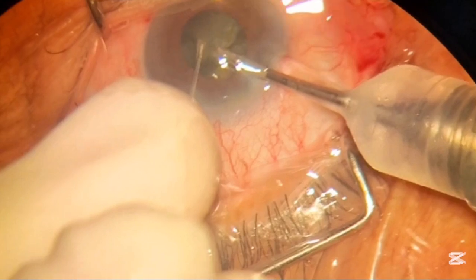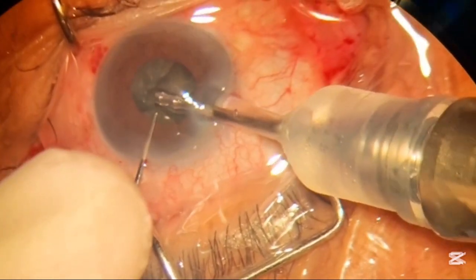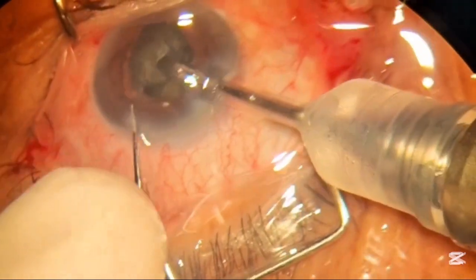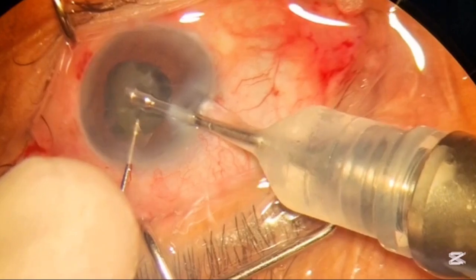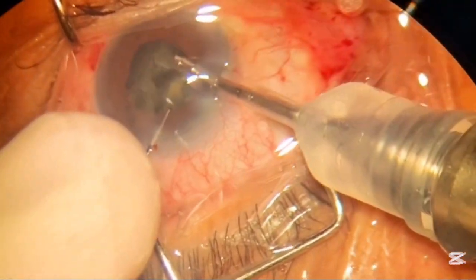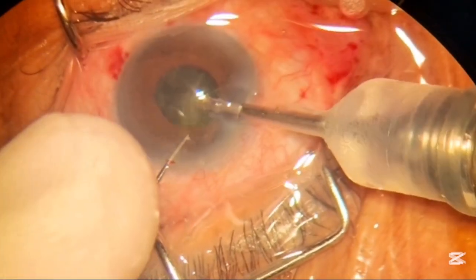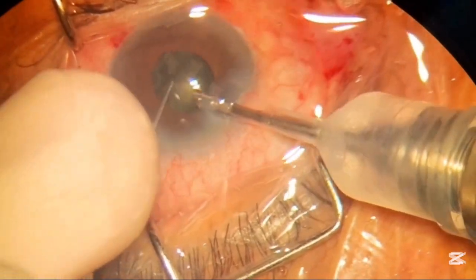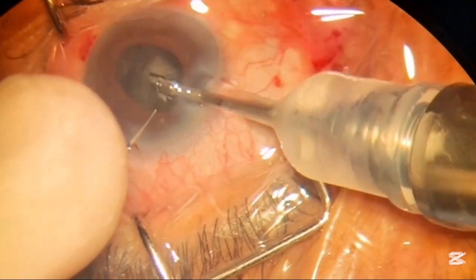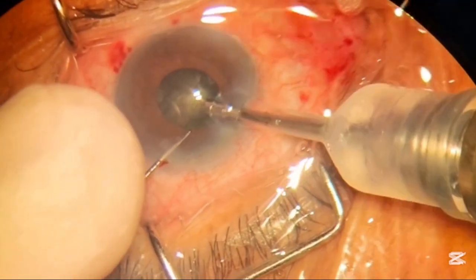Now you can see we are done with the breaks and we will start removing the small pieces from the bag. You can see the pupil is small in this case — it's not adequately dilated and the patient is constantly having head tremors, making this a surgically challenging case.